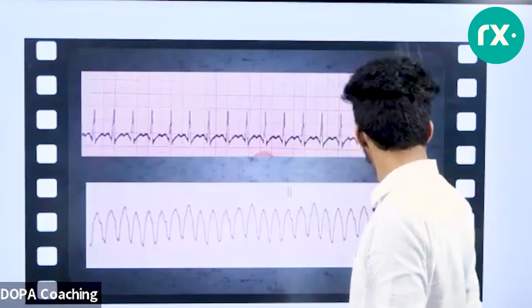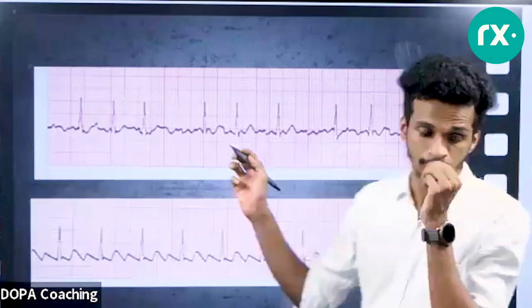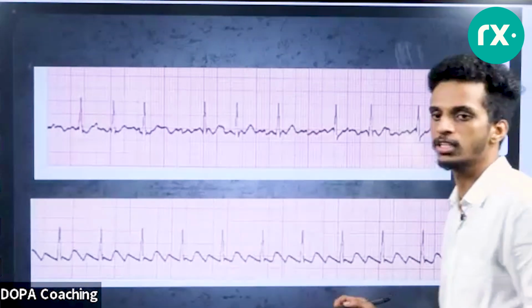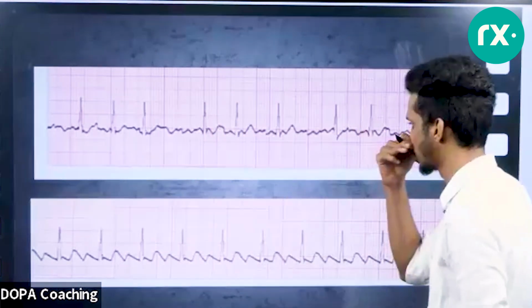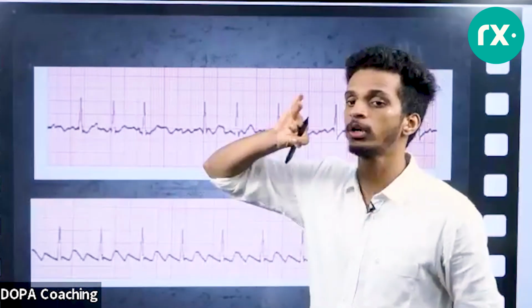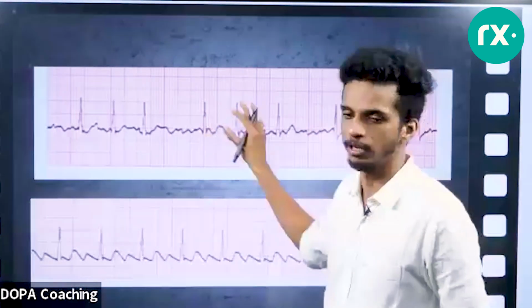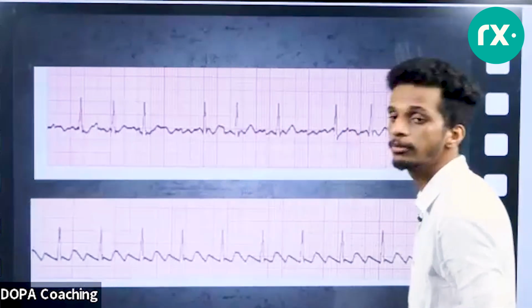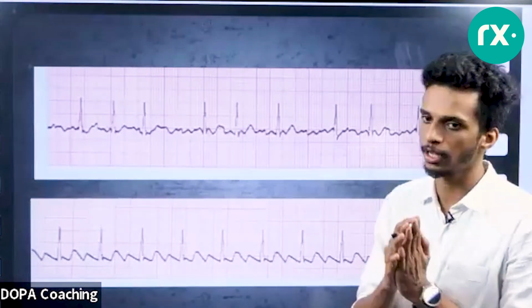So, let's continue. I have shown you atrial fibrillation, atrial flutter. I am seeing some doubts here, but I'll take them at the end of the session because we have to wind it up at least within 1.5 hours. So I'll take your doubts at the end of the session. If you are not able to understand any point, I'll deal with that at the time of discussion itself. But other than that, if you guys have any doubts, we'll take them at the end of the session.